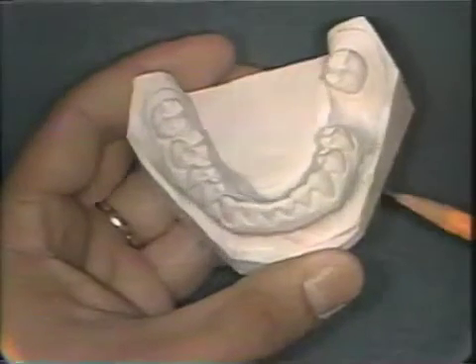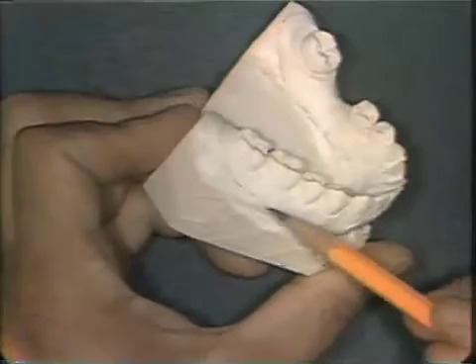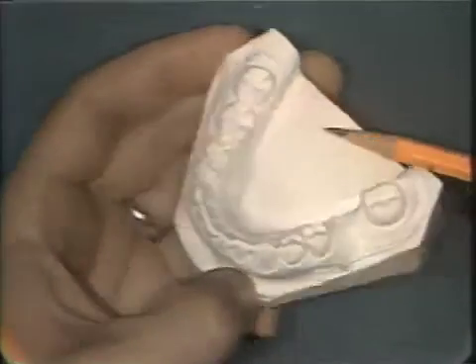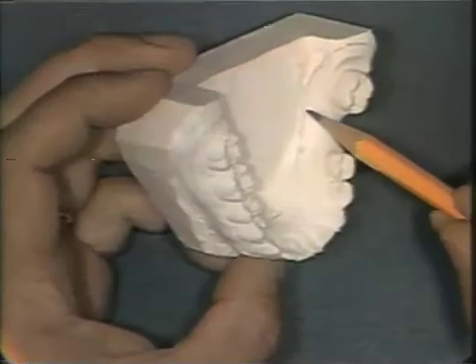The first step in the construction of a posterior acrylic tray is to outline the peripheries of the tray using pencil on the study cast. The tray must be extended to completely cover the teeth in the region where the bridge will be constructed.